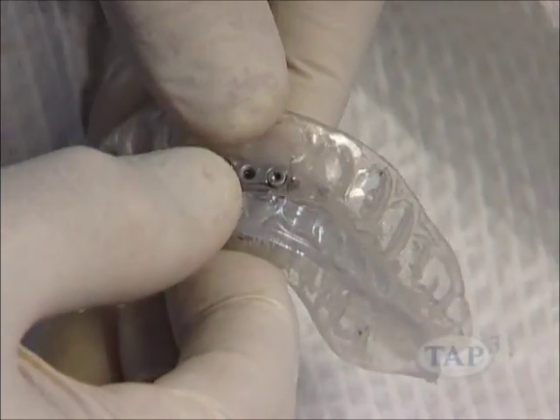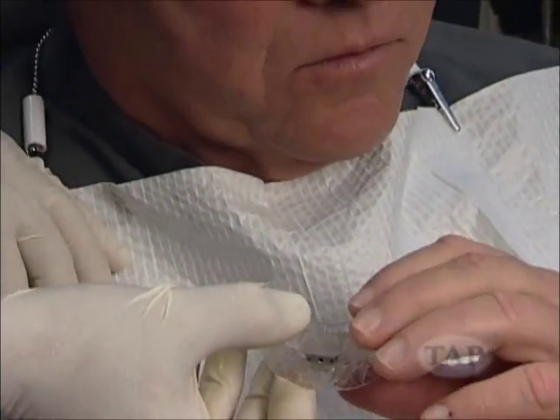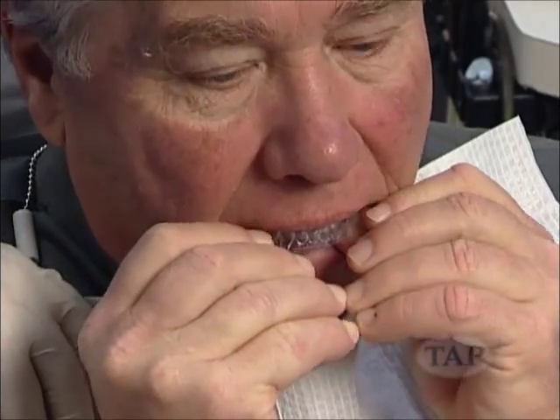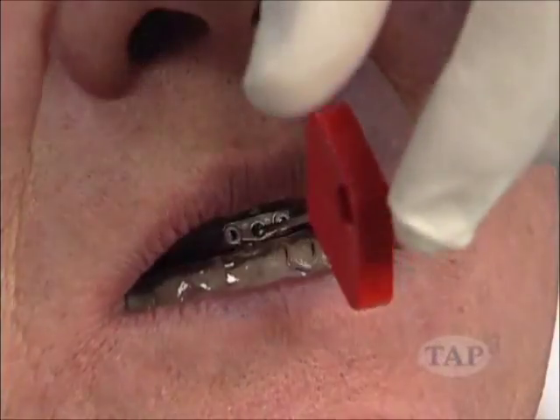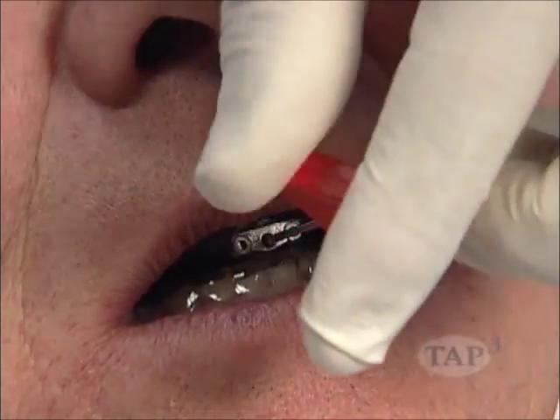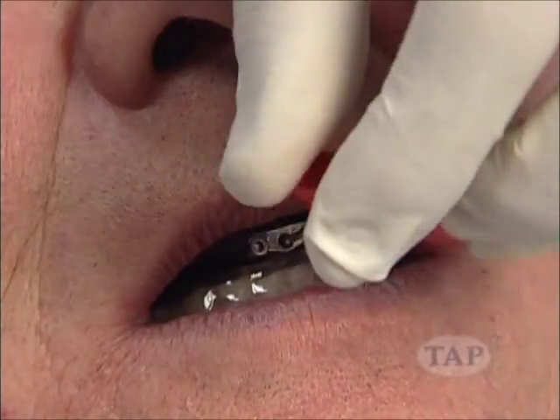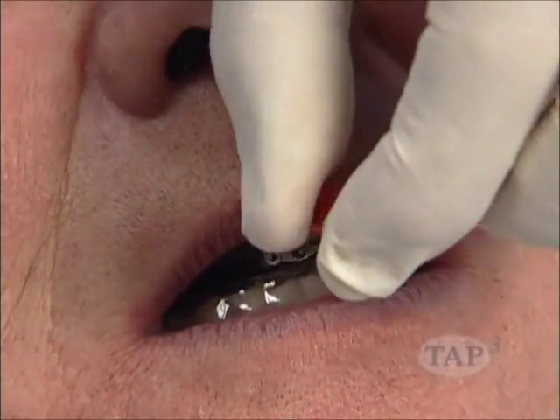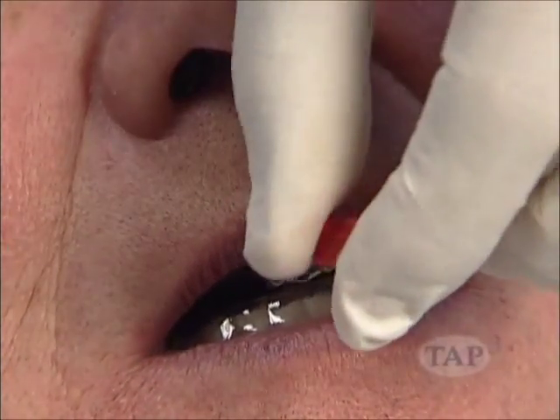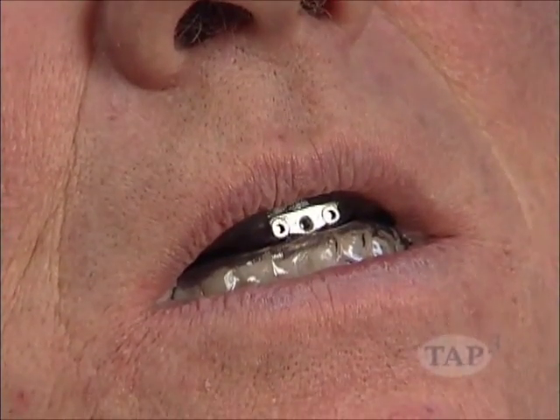Another way for the patient to place the device in the mouth is to hook the appliances together outside the mouth, and then place the conjoined trays in the mouth. Once the trays are in the mouth and hooked together, dial the patient forward to the patient's maximum comfortable position. Have the patient indicate when this point is reached. By taking the patient to their maximum comfortable position, you will know their range of protrusion.